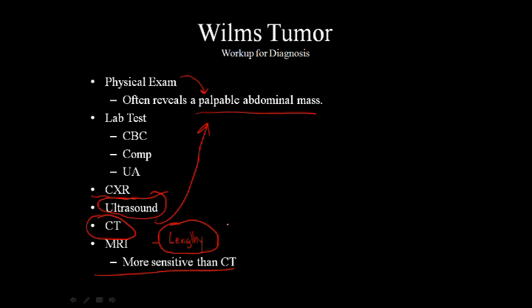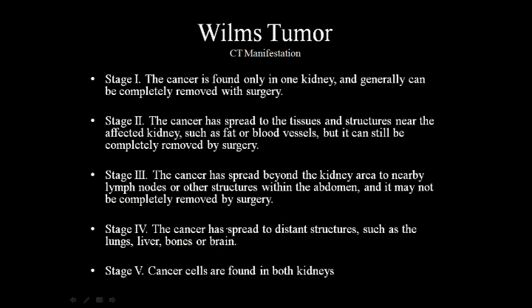MRI will be lengthy, and so there might have to be some type of pre-medication or sedation performed on the patient. So for the most part, CT aids in a very quick diagnostic quality, where an MRI and ultrasound can be further utilized. So let's look at the staging of Wilms tumor.